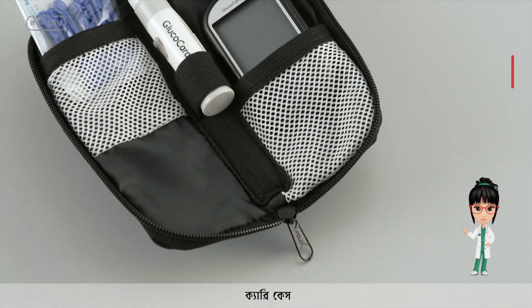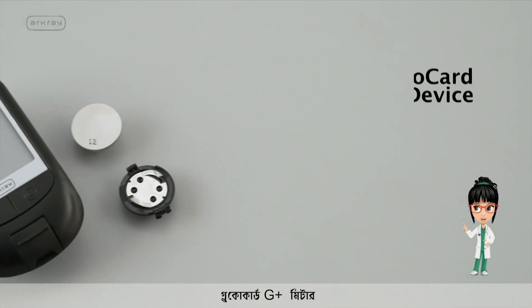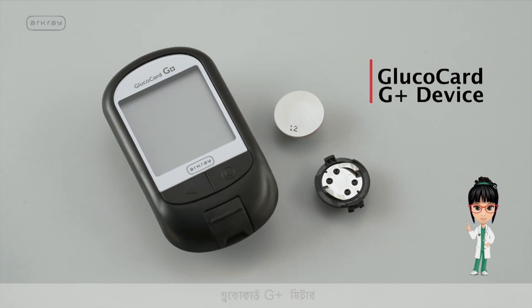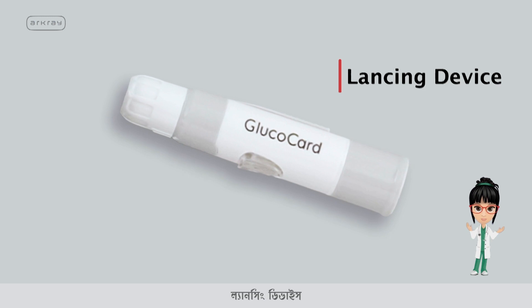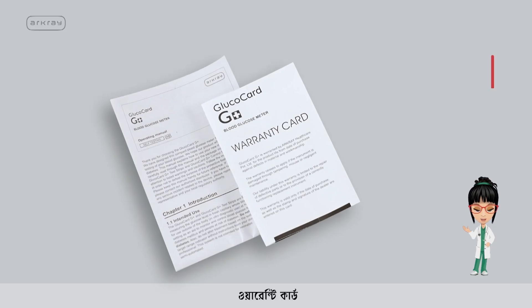The new Glucocard G Plus Blood Glucose Meter box contains an attractive carry case, the R-Cray Glucocard G Plus meter, Glucocard test strips, a lancing device, lancets, and a warranty card.